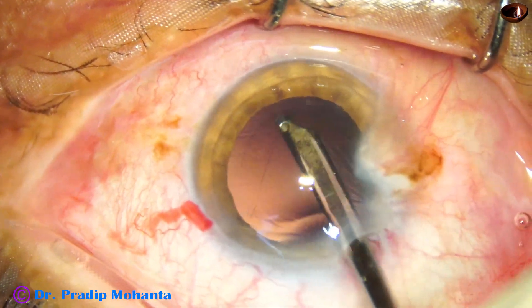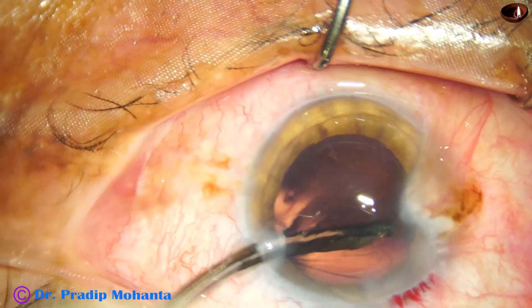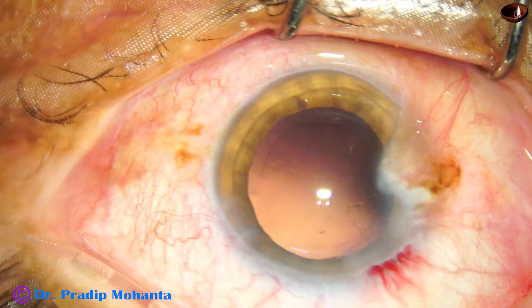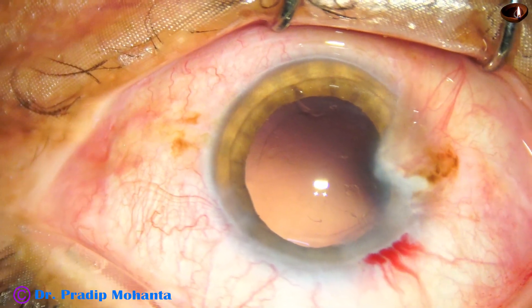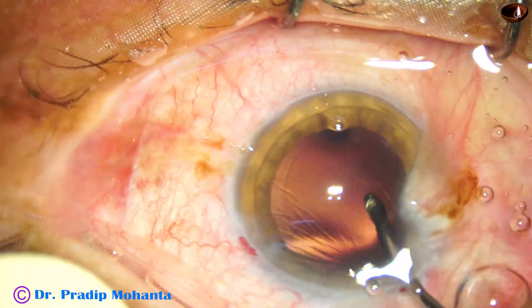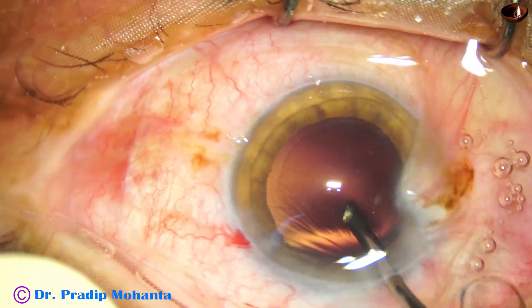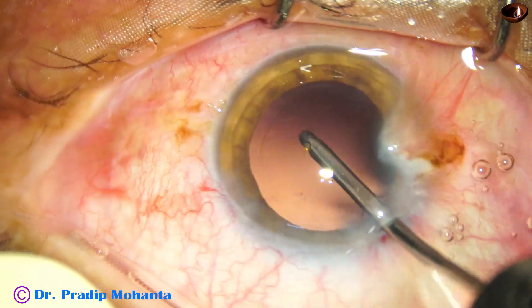A little bit of visco has been injected, and I am going to remove some fibers which are sticking to the posterior capsule here and there. Nice polishing is done, and now a hydrophilic acrylic single piece monofocal lens will be implanted.